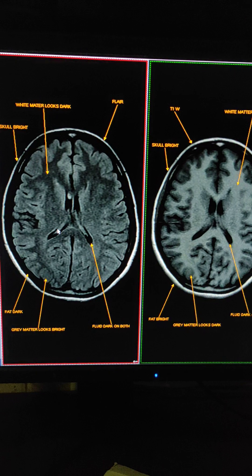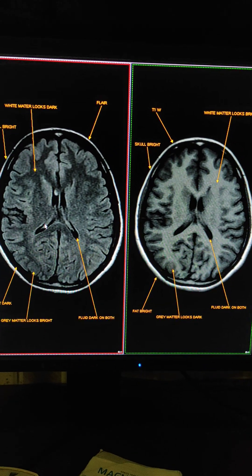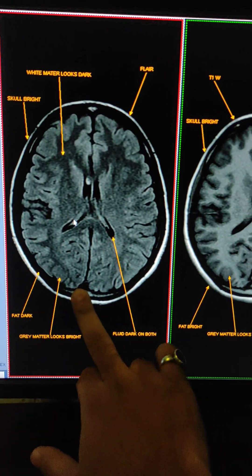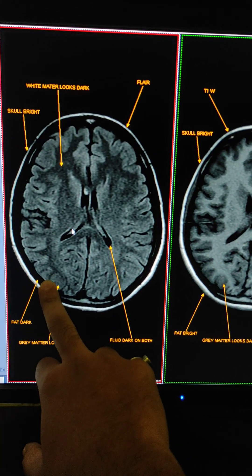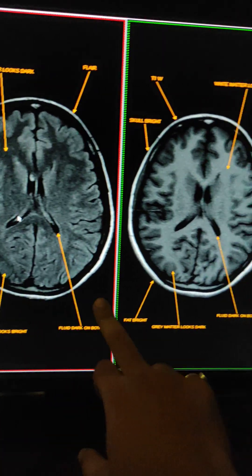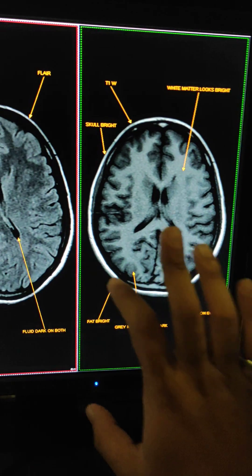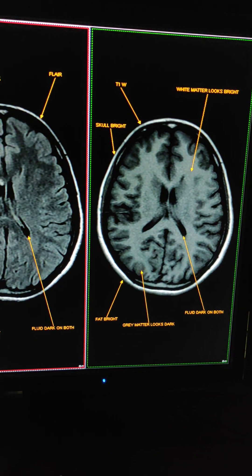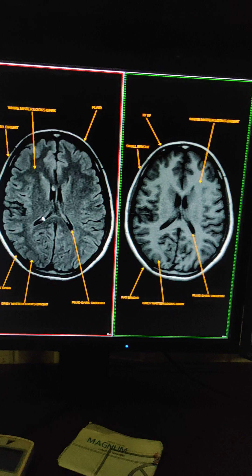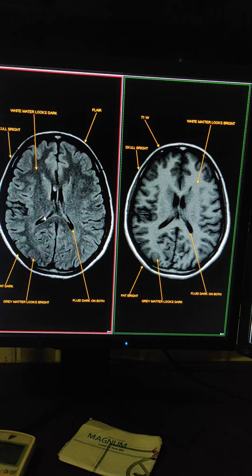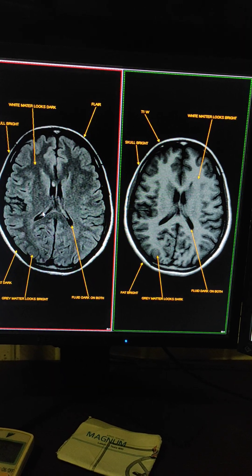Another thing you can use to differentiate is fat. In FLAIR sequence, fat looks dark. In T1 weighted sequence, fat is bright. From these things, you can differentiate between T1 weighted and FLAIR sequence.